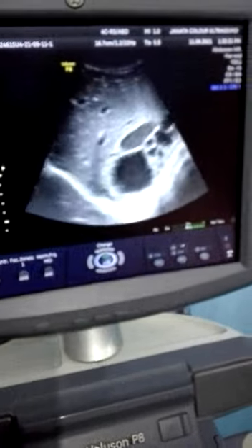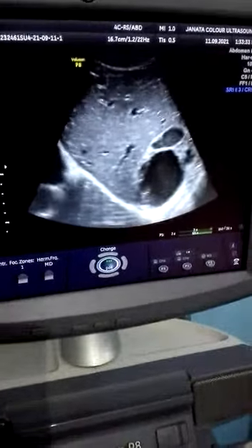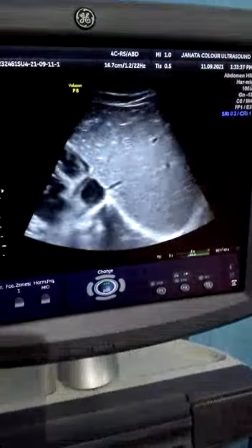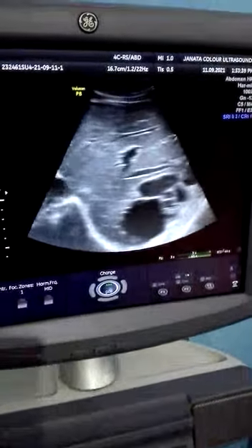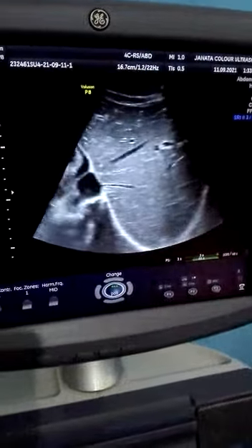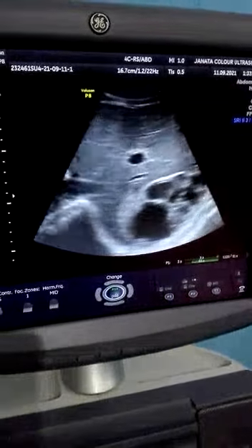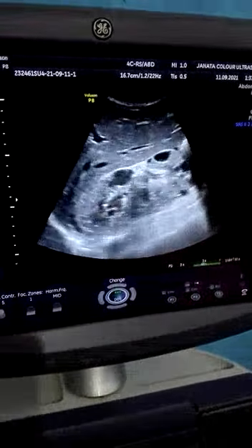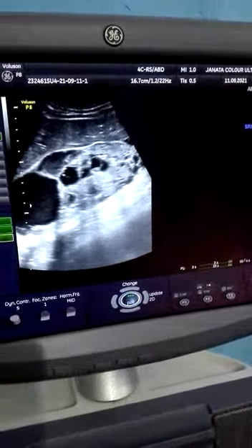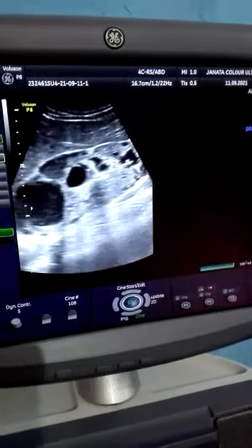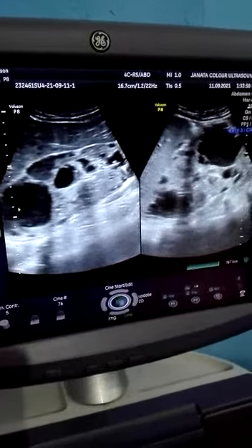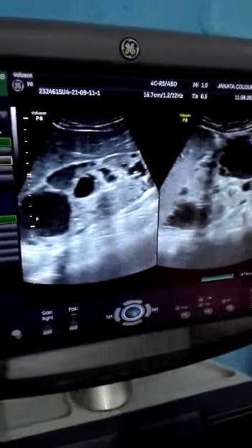A patient came for ultrasonography with complaint of pain abdomen and abdominal distension. While doing ultrasonography on this patient, we found that both kidneys of this patient are enlarged. This is the right kidney, this is the left kidney.